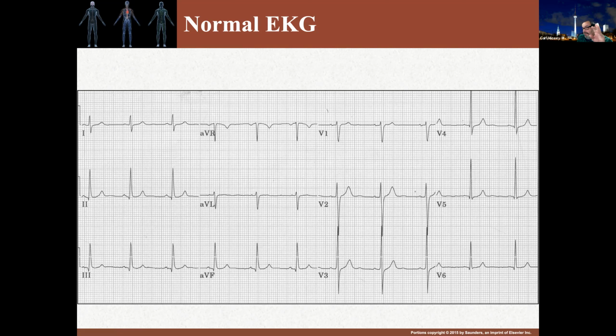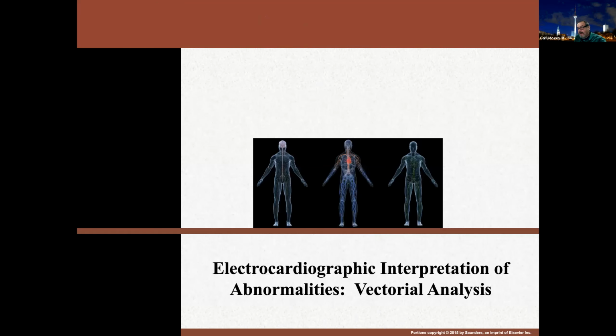Why this sequential recording of these triplets is important is because if an event occurs in, let's say, the first trio here, you do not see how that is reflected in the other 9 leads. You'll see it in 1, 2, and 3, but you won't see it in any of these other leads. That's why it's generally important to put in a kind of scout tracing which shows you all of them.